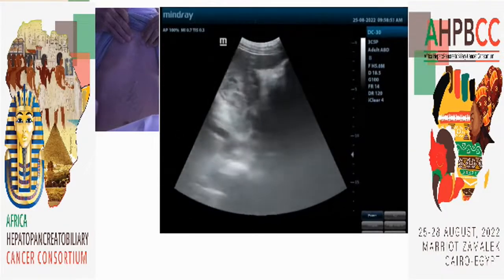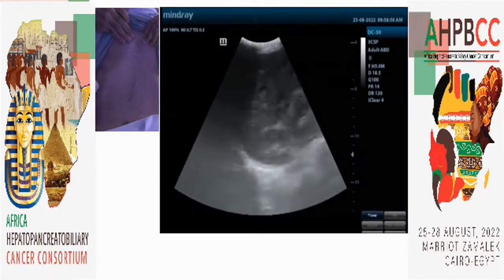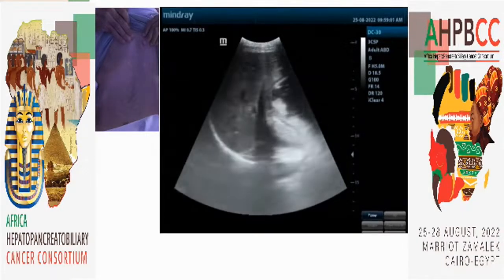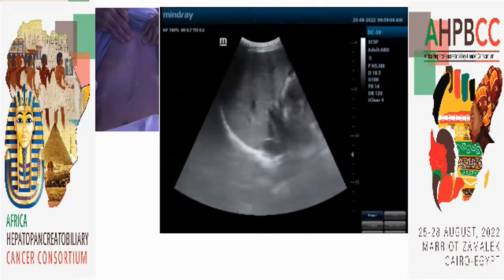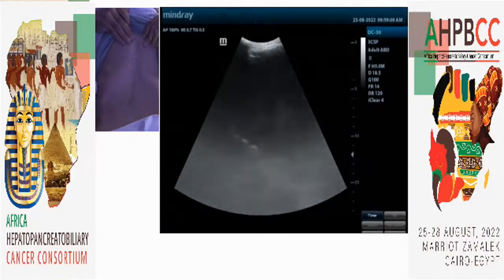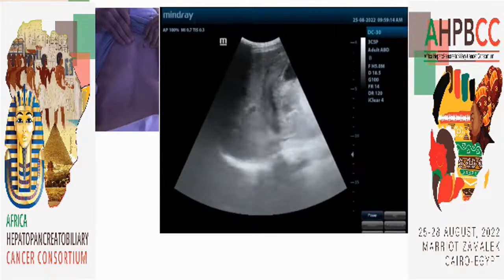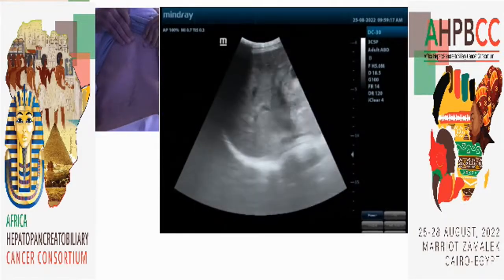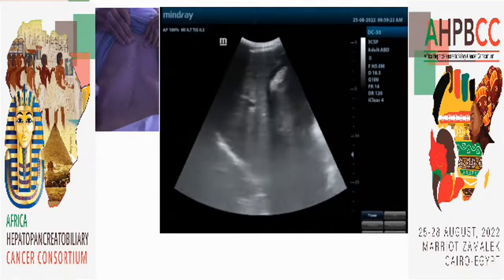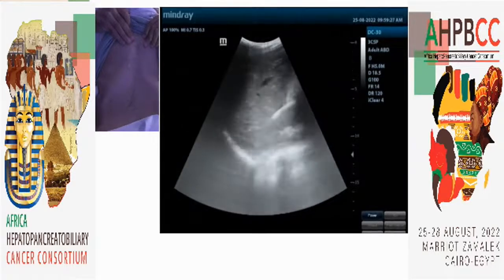Over here, you can assess the span of the liver and the kidney. And then you can go intercostal spaces. Take a deep breath. Space by space. And then at each space, you sweep or fan up and down with deep inspiration from the patient to closely and carefully evaluate the liver for any sign of focal change.